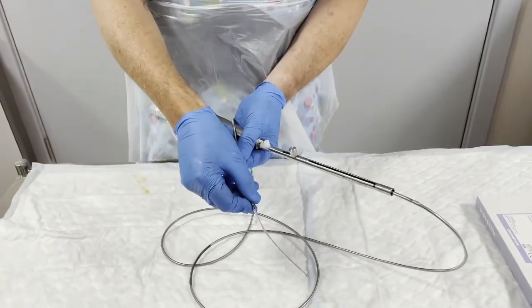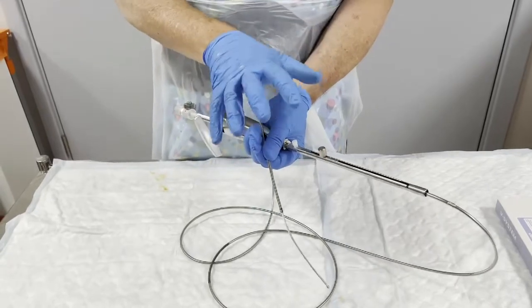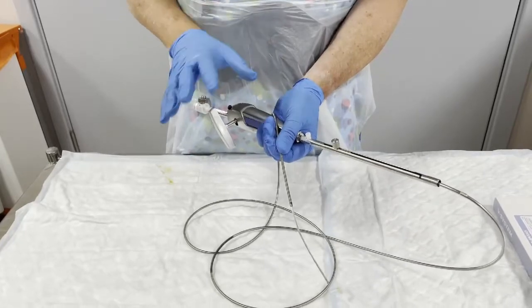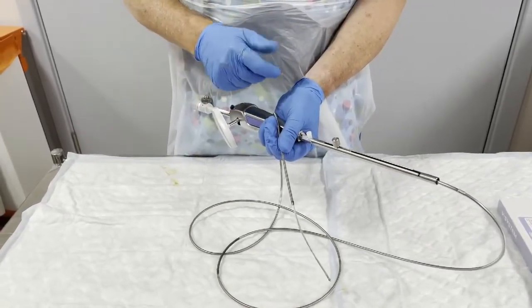So mechanical lithotripsy is a very useful bit of kit, but one has to fully understand exactly how to put it together and exactly how to deploy it around the stone and crush the stone.